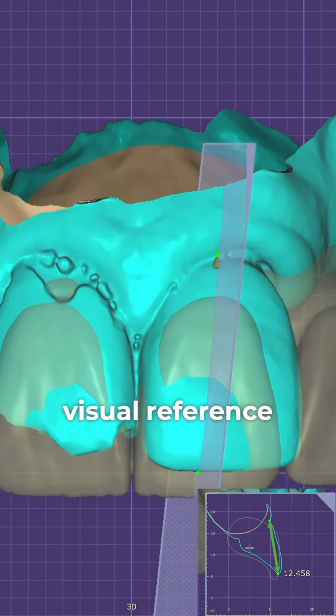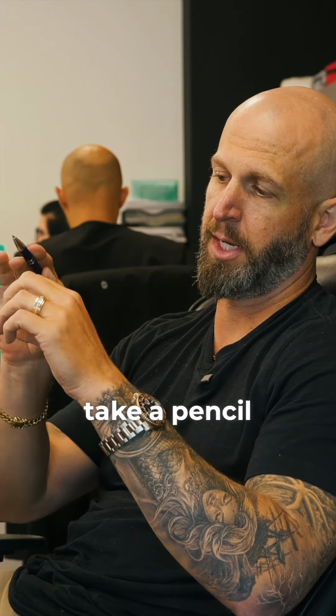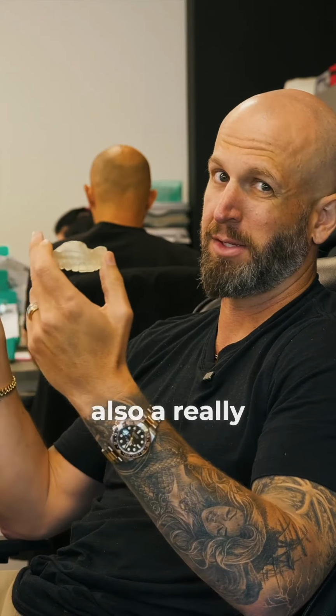Using these as visual reference points is nice because you can do a facial reflective flap, release that tissue, and then just take a pencil and mark, or you can take a surgical crosscut and mark. Having 2 existing implants is also a really good reference.